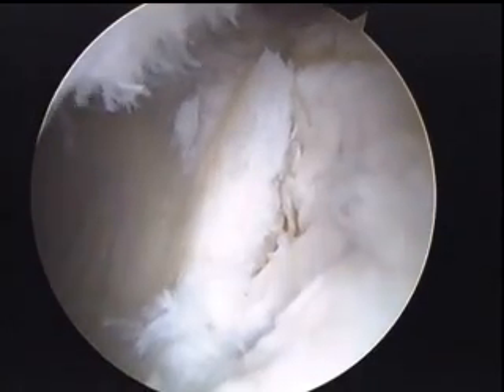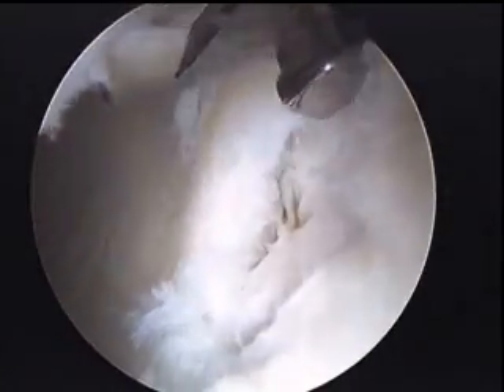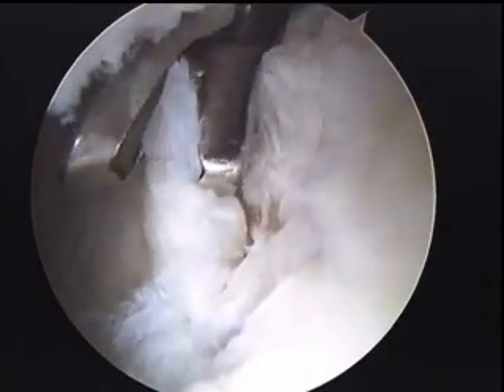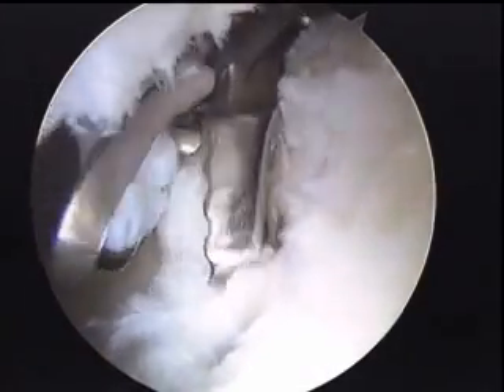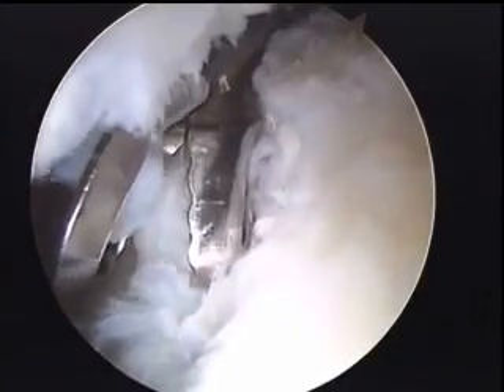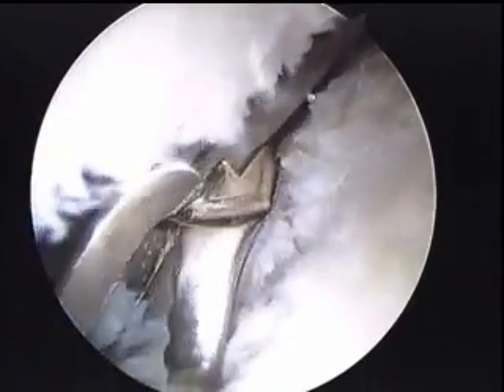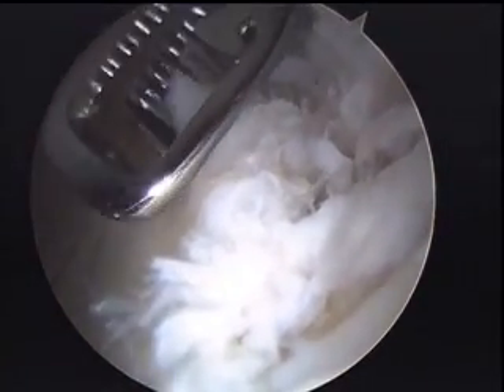As we see now, the labrum has been completely separated at its area where it was tearing. This is a biter again inside the hip of the cartilage delamination, taking care of the unstable cartilage. What you will see underneath there right at the base where it's flipping back is some yellow tissue — that is the bone of the acetabulum where the cartilage should be adhered very strongly. But with the chronic impingement and damage, it has caused this delamination and separation of the cartilage from the bone itself.